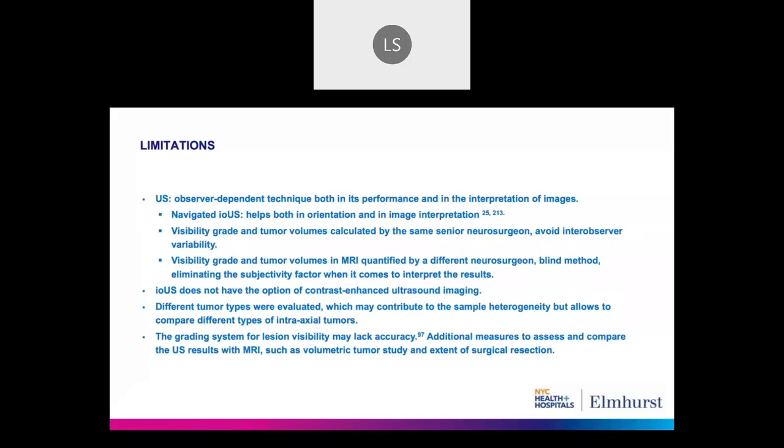Well, the limitations of what I've been talking about today and the study itself is again that the ultrasound depends on the person who's doing it, both to acquire the images and also to interpret the images. But if you fuse the ultrasound with the pre-op MRI and you use the navigation, it will help you to interpret the image and also to orient yourself, right?